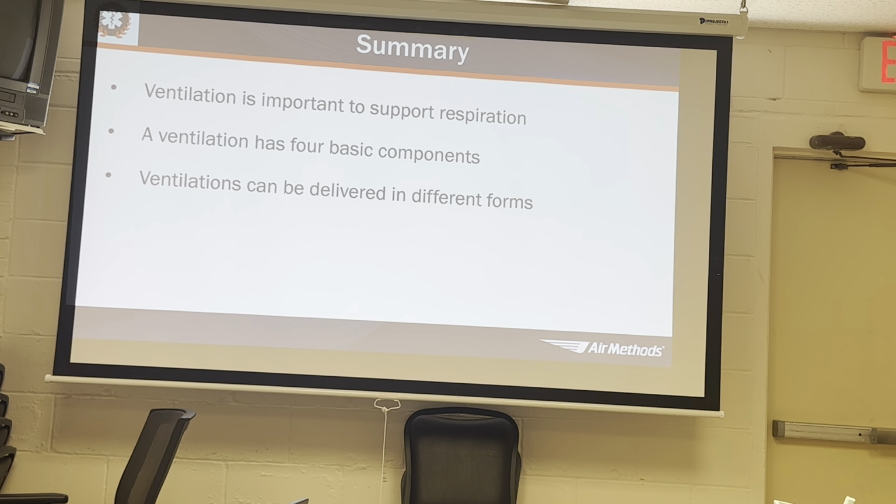end-tidal CO2, probably the greatest thing ever invented. I think it's underutilized in hospitals, and maybe sometimes overutilized in the pre-hospital realm. But it helps you as a nurse know, hey, is my patient being underventilated or ventilated too much, and so on and so forth. So if you do have the capability to do it, throw that on there, because that really is very beneficial to know at the bedside.